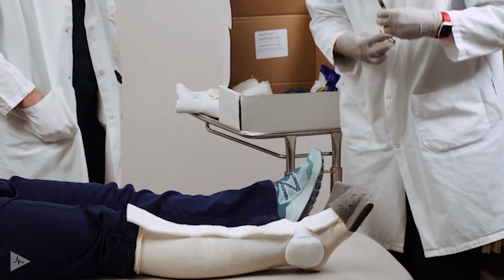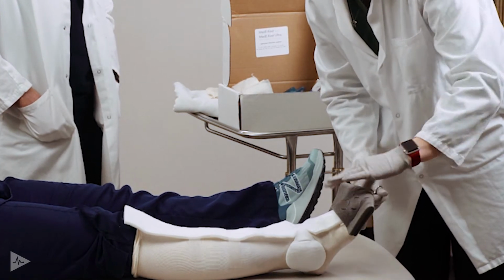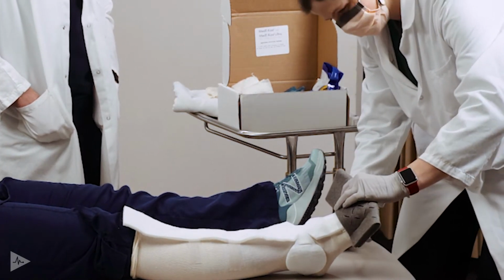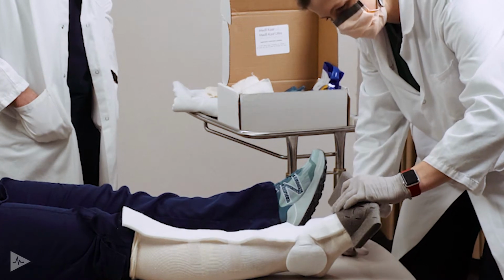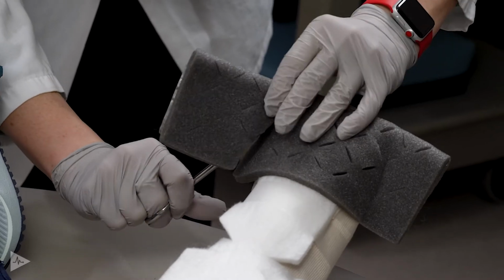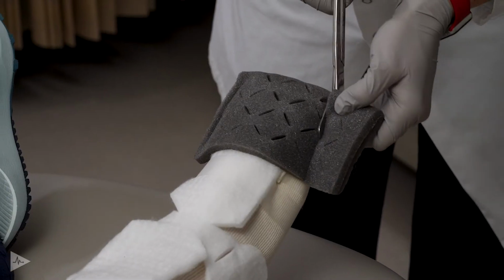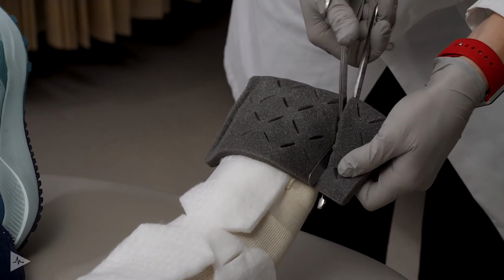And we will trim the excess from the sides. So I like to place my hand on the inside so I can guide as I'm cutting, so I don't risk injuring the patient at all. So we'll continue to trim up along the edge of the foot and follow that curvature. We'll come finish on both sides. So now we have the extra protection added to the toe area.